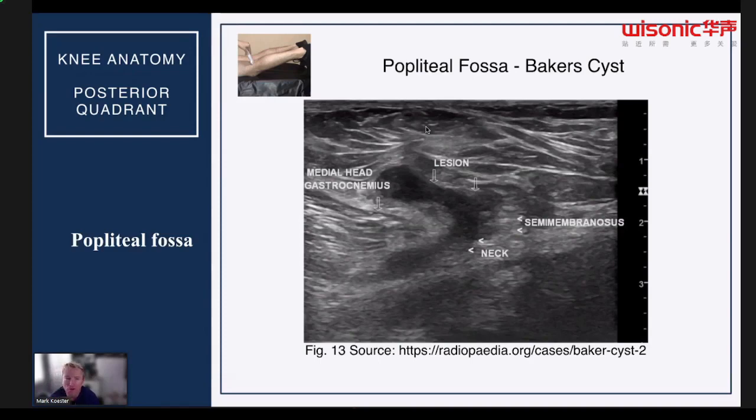When you inject PRP or bone marrow, do you inject from the suprapatellar aspect into the joint or from the anterior joint capsule? Sorry, I muted here. So it's really going to depend on the structure that you're trying to target with this. You can do it from the lateral aspect, but it really just depends on the structure that you want to target.